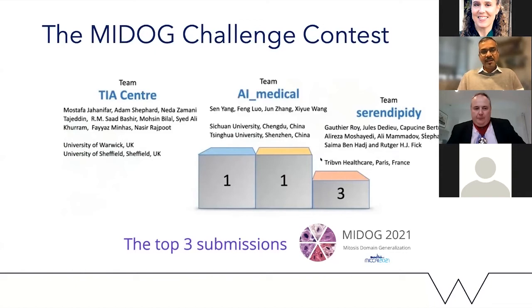And this is where, again, in a diagnostic setting, these algorithms can hopefully help you in that very boring, laborious, tedious process of figuring out exactly where the mitotic cells are, and sometimes even determining the right kind of high power fields to identify those mitotic cells in. And the beauty here is that you can run the algorithm on the entire whole slide image, across the entire slide, and can pick out hotspots of mitotic cells. And you can perhaps then go in there and verify the results of the algorithm, and finally put out your own diagnosis using the results of that algorithm.